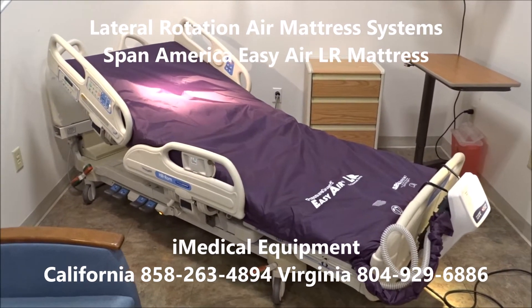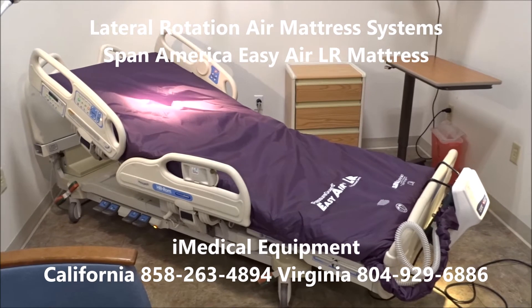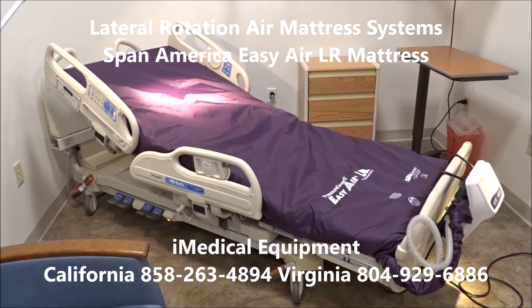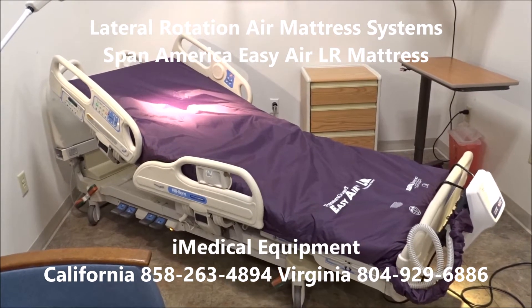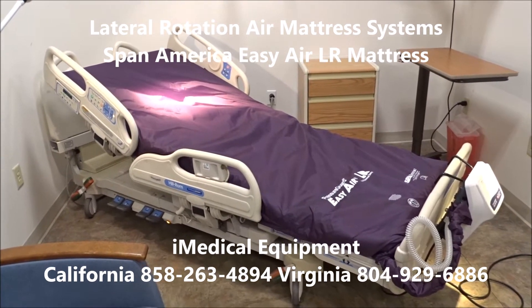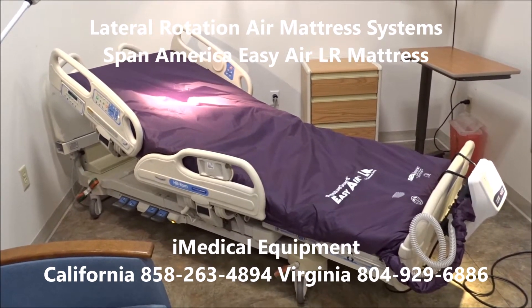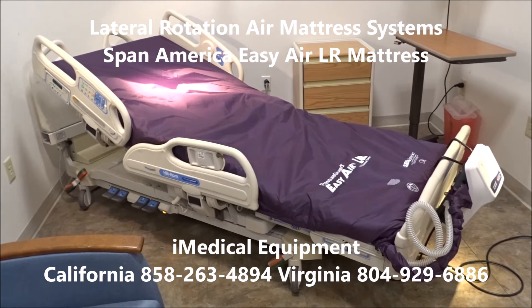This is one of the top packages that we offer right here. This is the SpanAmerica Pressure Guard Easy Air LR — LR standing for Lateral Rotation Air Mattress System — specially built to form and conform to the VersaCare, the Hilrom P3200 VersaCare bed frame.